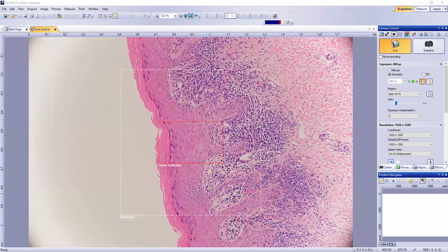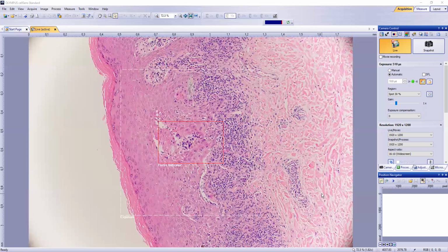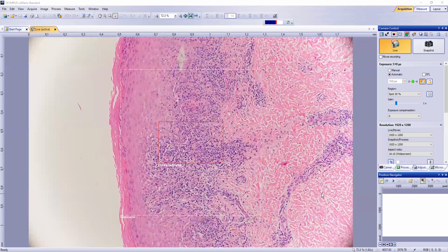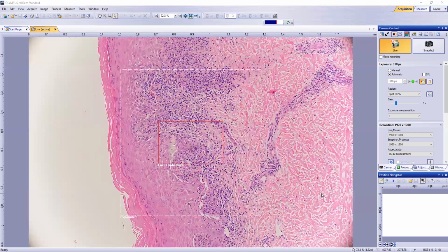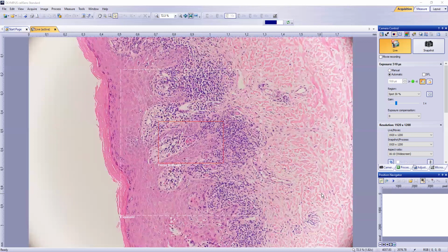The epidermis is hyperplastic, and it's irregularly hyperplastic in a jagged or sawtoothed-like fashion. And you can see the sharpening of the rete pegs down to points. So it has that jagged look to it. In addition, you have that heavy band-like or lichenoid infiltrate that is obscuring the dermal epidermal junction, and you start to appreciate clefting associated with vacuolization of the basal epidermis. These are called Max-Joseph spaces, and they're very characteristic for Lichen planus.